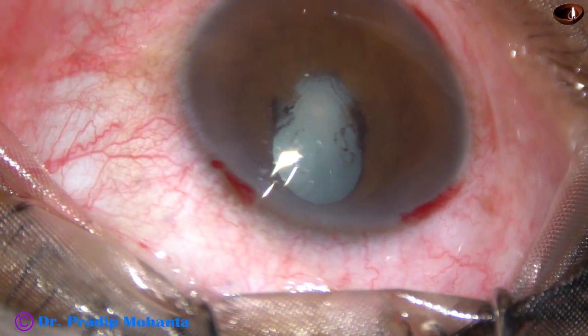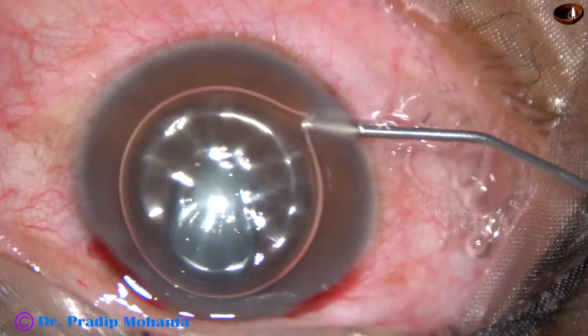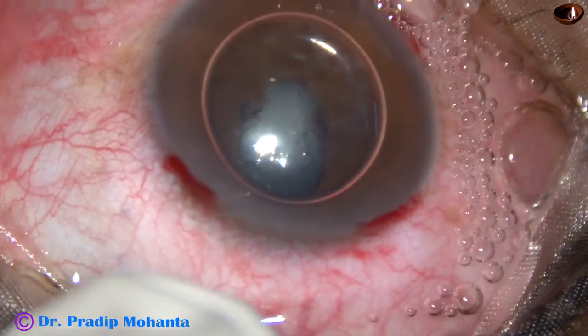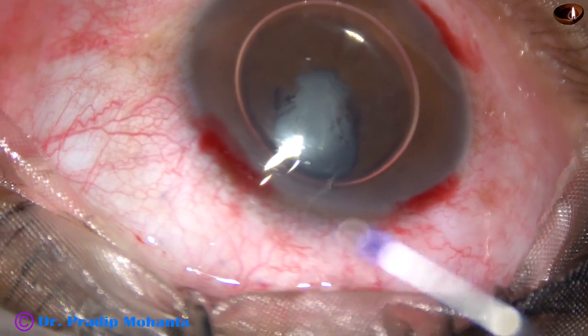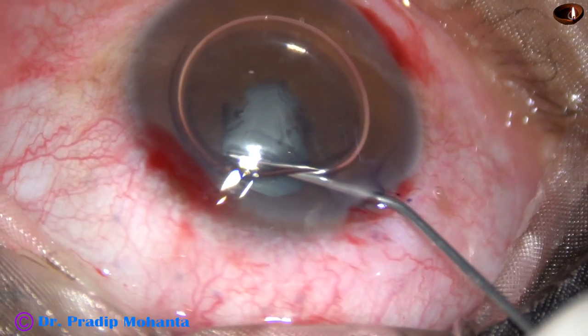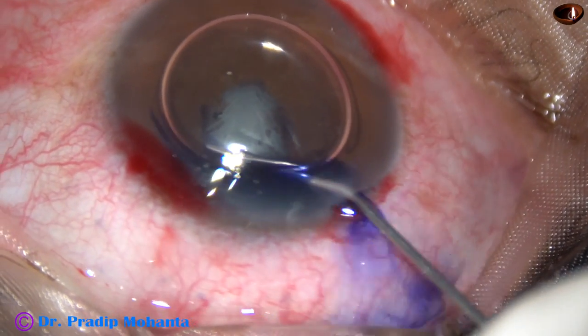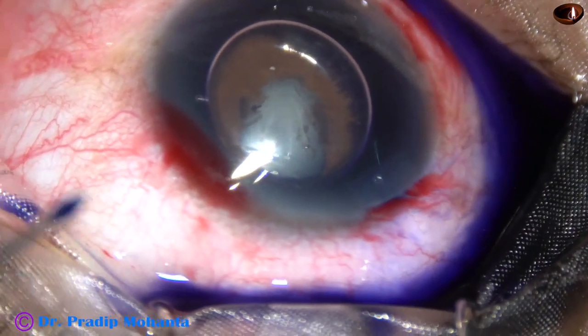So two side ports and one main wound. Now I inject an air bubble and then inject trypan blue dye. I have to inject trypan blue dye behind the iris in this case. So I go behind the iris and inject some dye.